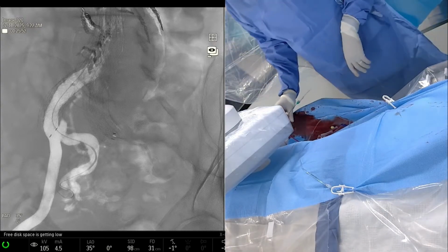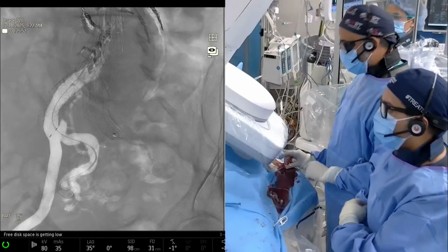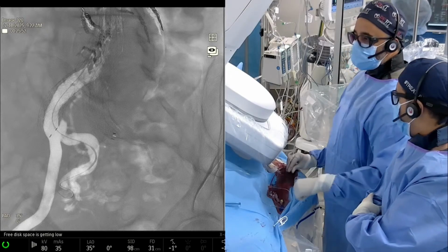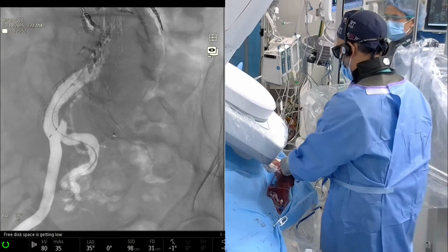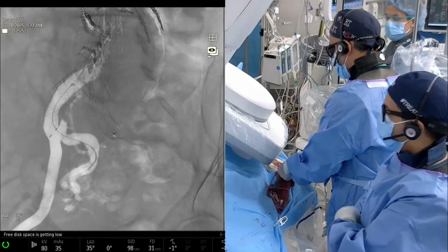So the diagnostic catheter is a 4-125 VER, and then we just used an LT glide, a long taper 150 centimeter LT glide. If this doesn't work, then I would actually switch to a microcatheter system and try to use the micro wire because you can shape it. Yeah. But now that I'm all the way down, I could.